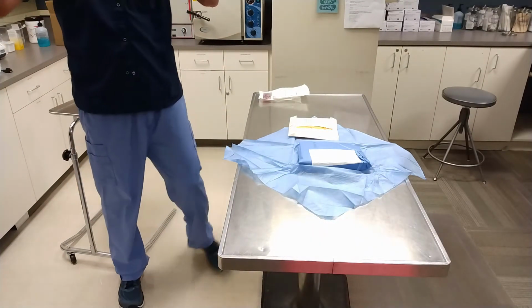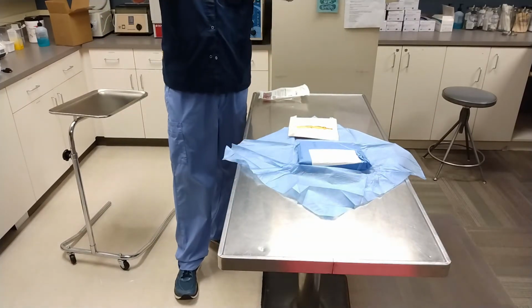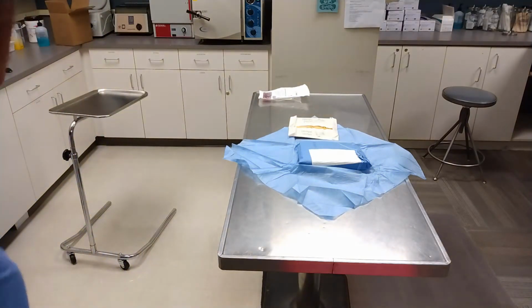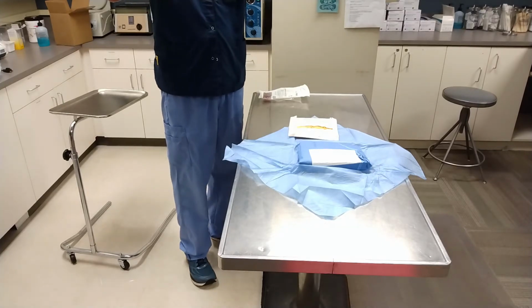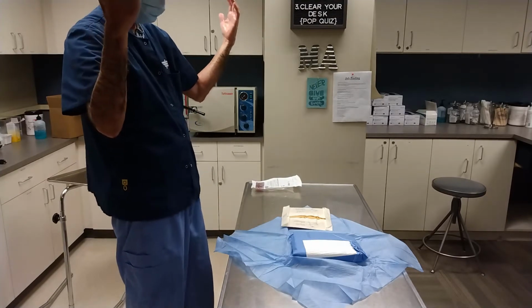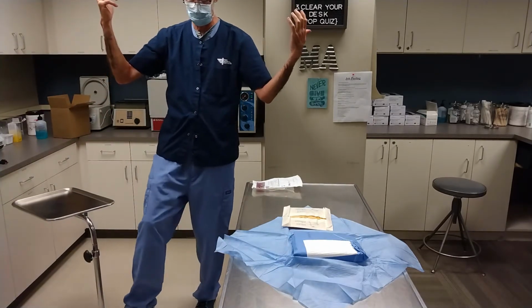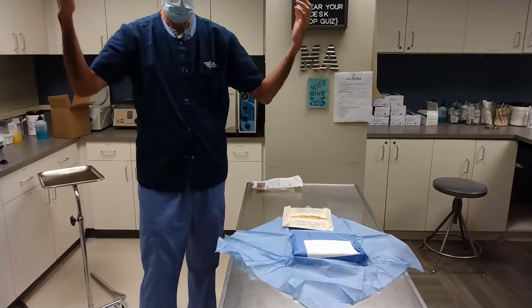Okay, so one thing, see me? I am holding my hands above my waist. That's very important. I'm coming through doors, using my backside. I'm not touching anything with my hands or with my arms. Approaching my back table, I'm not going to turn my back to it, okay? This is my sterile area. I can't turn my back to it. If I need to move something around, I do it with my foot. No touching anything with my hands or my arms.